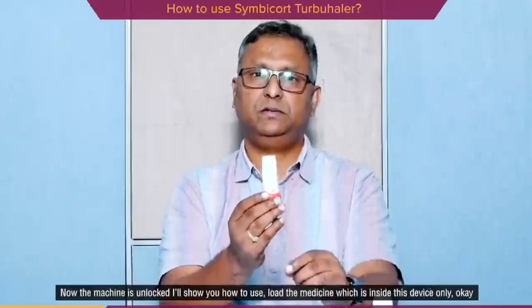Now the machine is unlocked. I'll show you how to load the medicine which is inside this device.